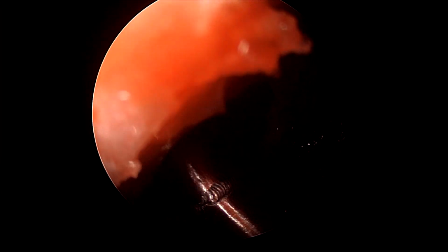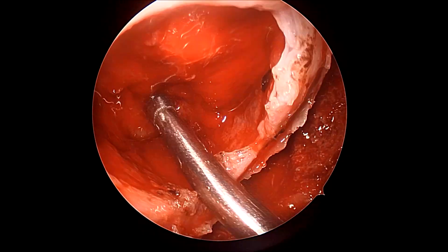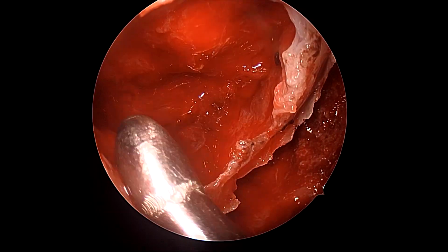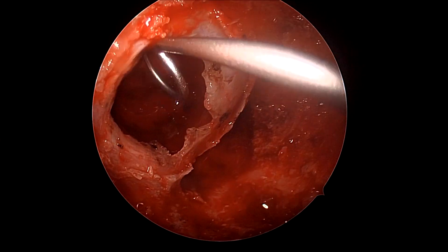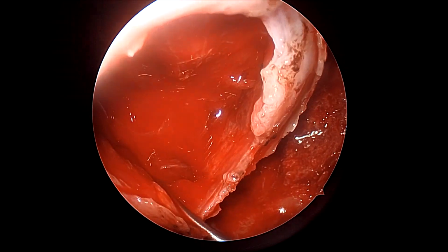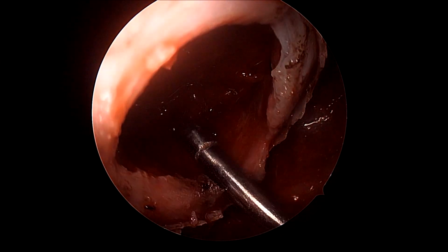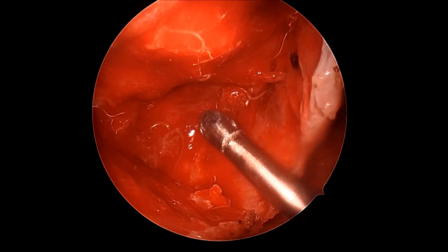And now, as you see, we're using an angled endoscope, a 45-degree angle endoscope, looking left-sided laterally to see the tumor. And again, we're using our very tapered skull base suction as an instrument to keep palpating the tumor gently, knowing that this much suction force would not really injure or cause any untoward complications in the surgical field.